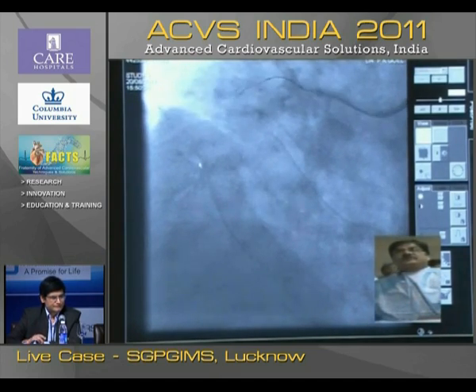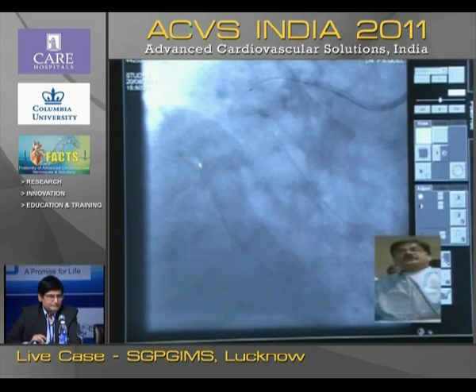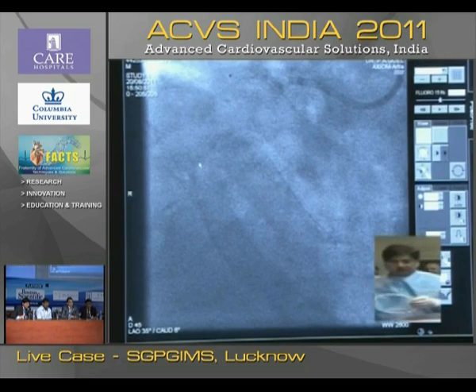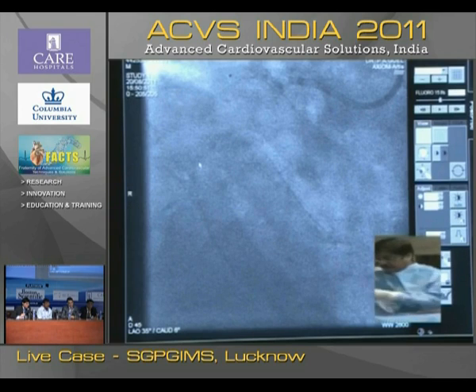It is not moving much forward. Dr. Goyal, do you want to take Conquest Pro directly, or you can try Miracle? I'll show you one. No, I will go straight to Conquest Pro now.